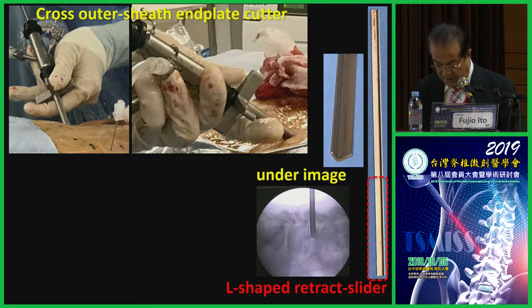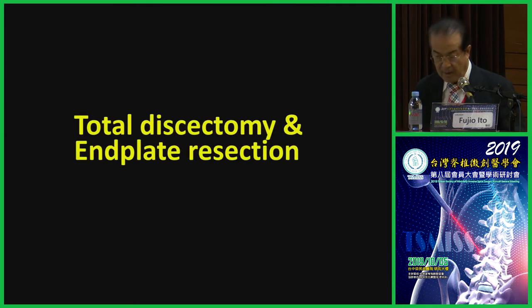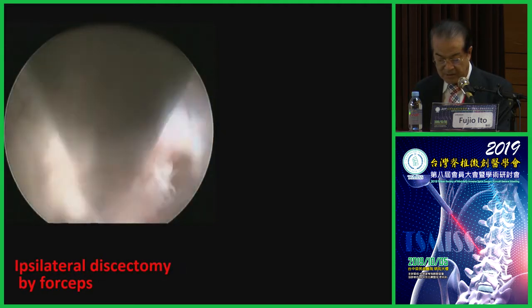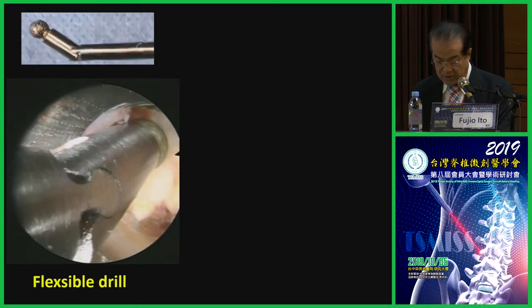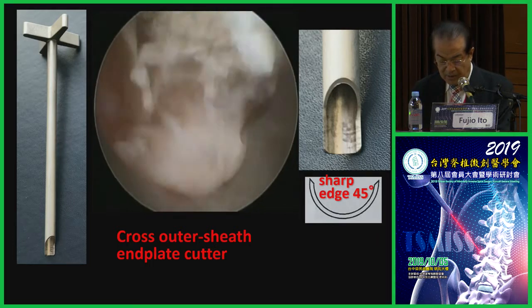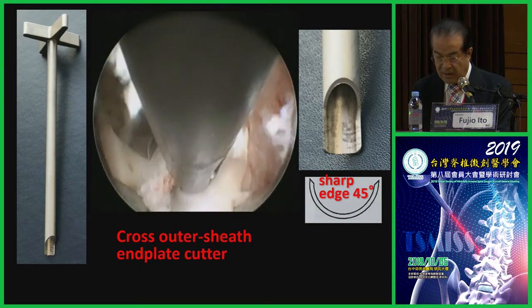The L-shaped retract slider inserts an interbody cage while protecting the exiting root. These are PPS insertion devices that can be used with conventional TLIF. It's important to reasonably remove the entire intervertebral disc and end plate. First, remove the intervertebral disc from the ipsilateral side with forceps under the endoscope. A flexible diamond burr helps to shave the end plate within a narrow outer sheath. Then rotate the cross outer sheath end plate cutter and scrape the end plate thinly and actively.